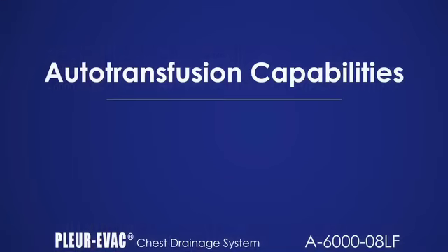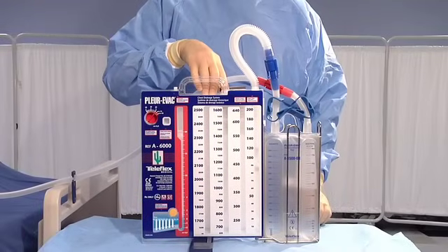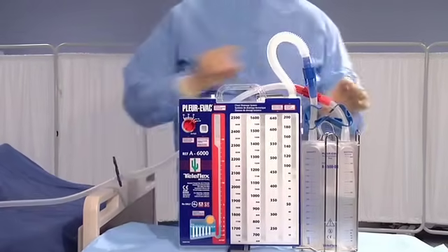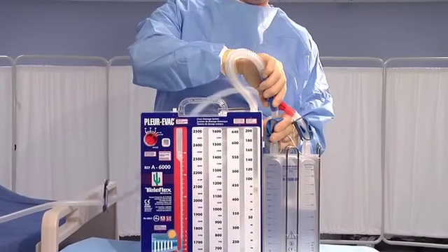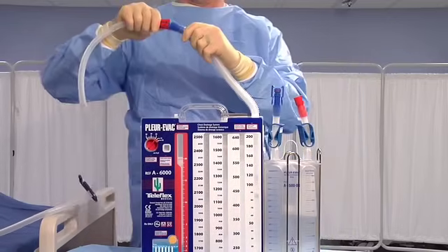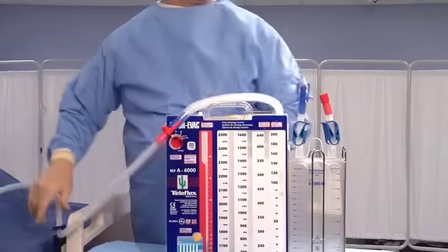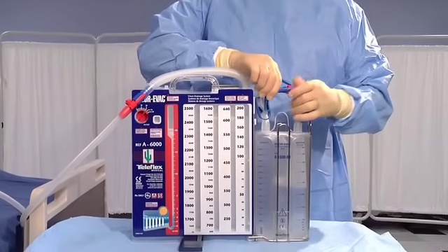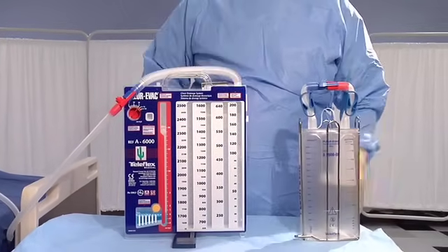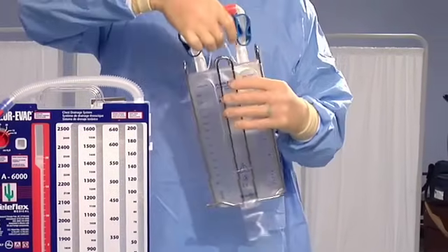To remove the auto-transfusion bag, use the high-negativity release valve to reduce excessive pressure to the prescribed level if applicable. Close all clamps of the patient tube and auto-transfusion bag. Disconnect the red and blue connectors. Securely attach the blue and red connectors in the patient tube. Open the patient clamp. The Plurivac unit is now operational. Attach the red and blue connectors on top of the auto-transfusion bag. Remove the bag from the Plurivac unit by disconnecting the hanger and foot hook. To prepare the auto-transfusion bag for re-infusion, slide the wire frame off the bag and discard the frame.